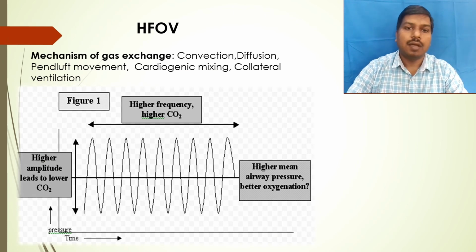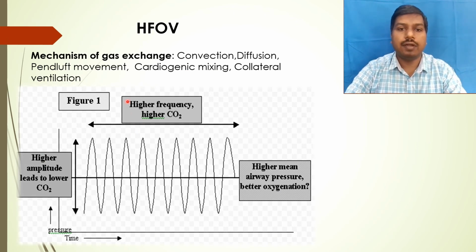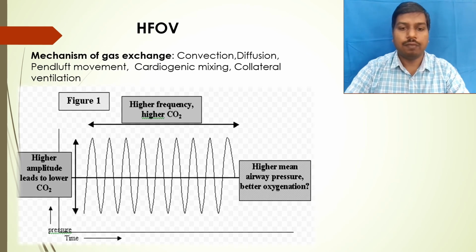Another mode is high frequency oscillatory ventilation. It gives very small tidal volume at a very high rate, and the gas exchange occurs through convection, diffusion, pendelluft movement, cardiogenic mixing, and collateral ventilation. It's used in severe cases of ARDS before going for ECMO.